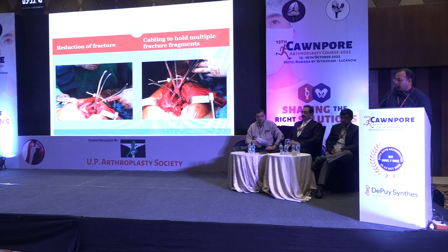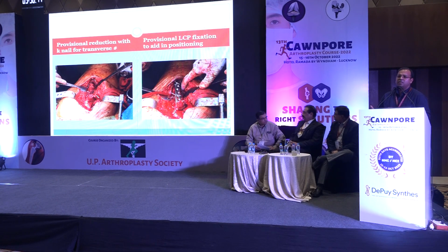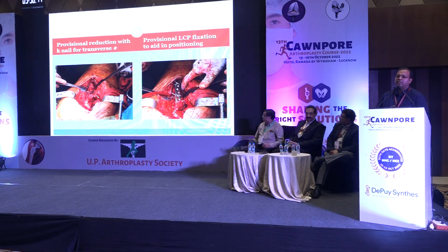Then, from multiple fragments, we formed a proximal sleeve. After forming the proximal sleeve, I used a K-nail to align the proximal sleeve with the distal sleeve. And the problem was when I tried to reduce or dislocate it, there was rotation instability. The distal femur would move out and the proximal would stay back. So I provisionally fixed a long LCP with the SS wires so that I have a single fragment together and I could ream it properly.